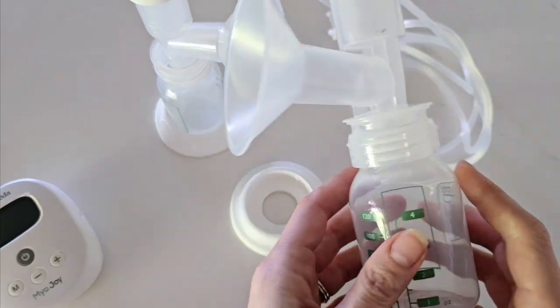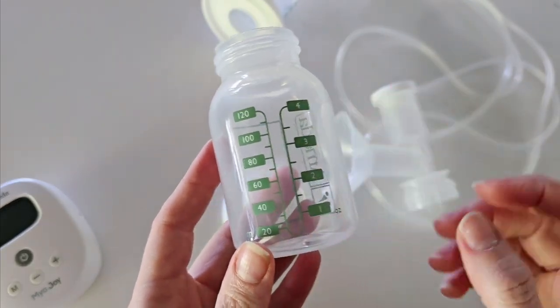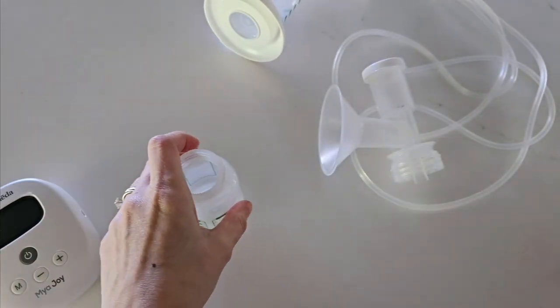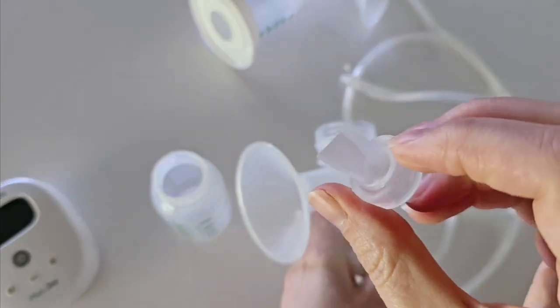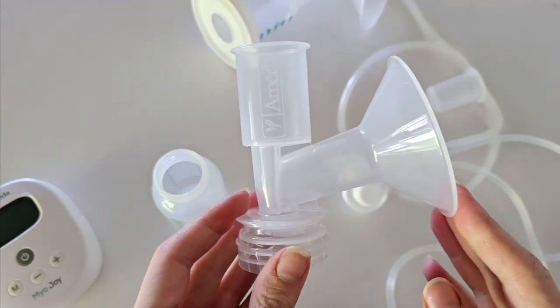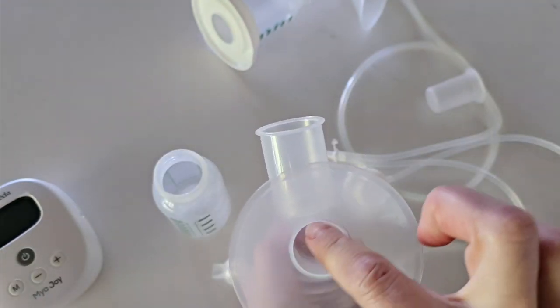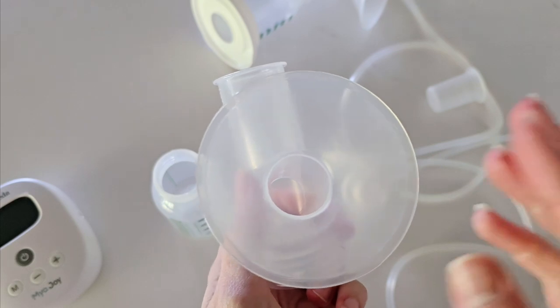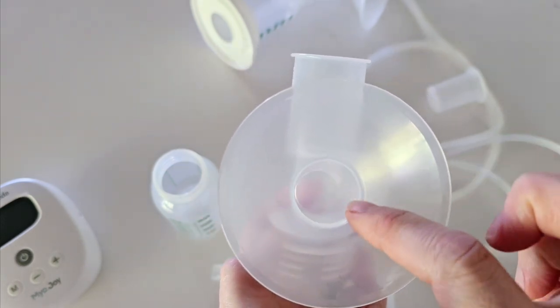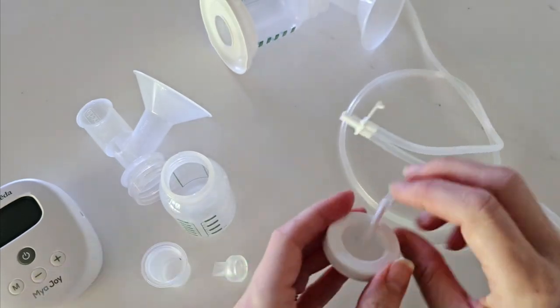Let's take a look at your collection container. It is a pump-to-bottle setup. You have your Amida bottles — these are four ounce and can stand upright using your bottle stand. Next you have your duckbill valve, then your flange which comes in a 25 millimeter or a larger 28.5 millimeter size. That is simply the diameter of your flange tunnel. If you need a smaller flange you can also purchase flange inserts separately, which will reduce the size of your tunnel to better fit your nipple.